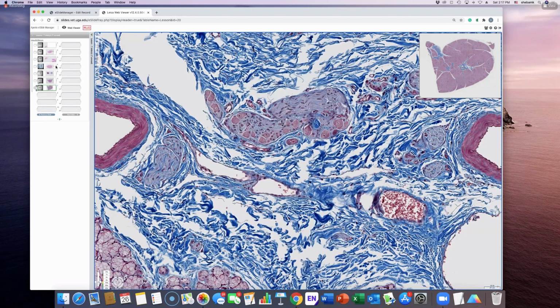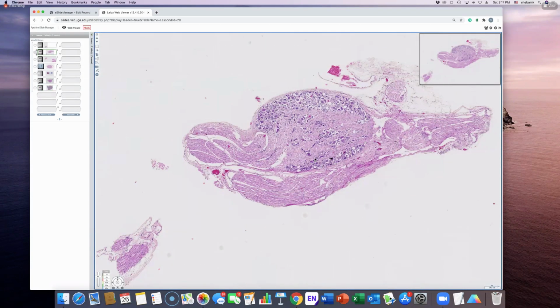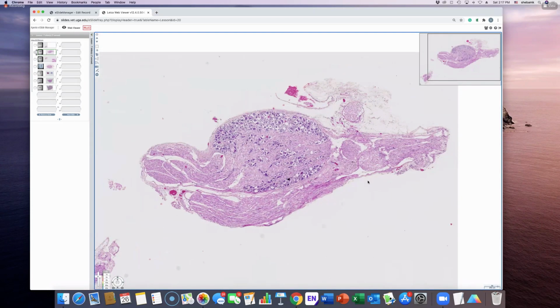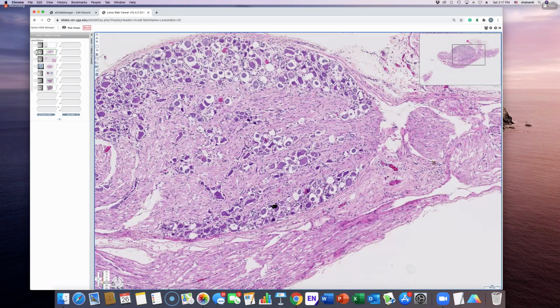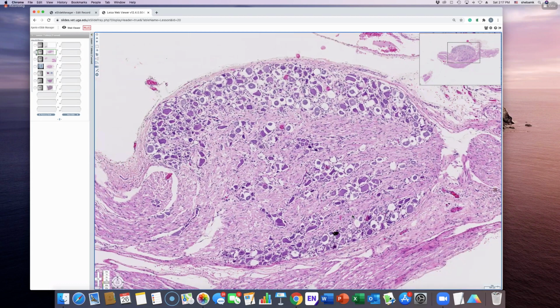We need to look at one more structure. This is a peripheral ganglion, right? So this guy here, who is this? This is a special guy. The dorsal root ganglia? Dorsal root ganglion, awesome. What kind of ganglion is it? Yes, these are all sensory neurons. Okay, are they unipolar, multipolar, bipolar?